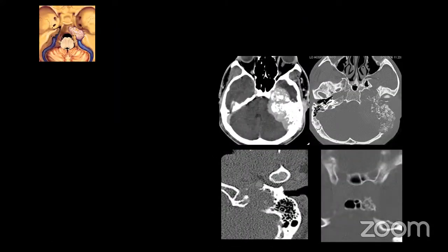So the next common pathology that we'll talk about involving the central skull base is typically these lesions that arise from the petrochlival fissure. The chordomas tended to be central, but laterally we can sometimes see these lesions arising from the petrochlival fissure, and they are solid masses that are often associated with dystrophic calcification. And it can have a variable appearance.